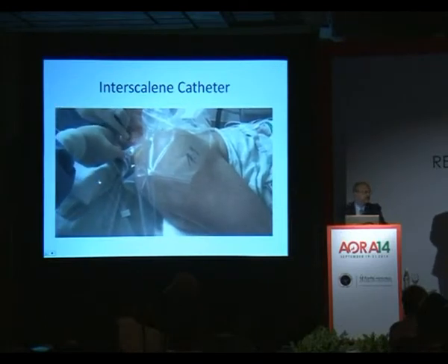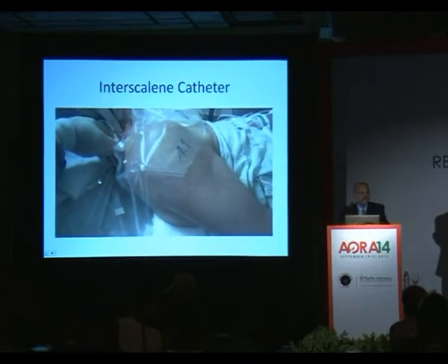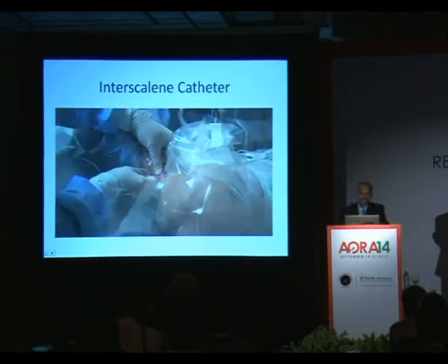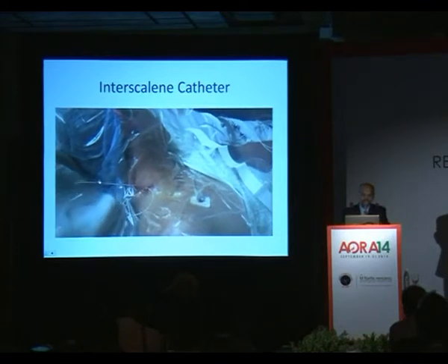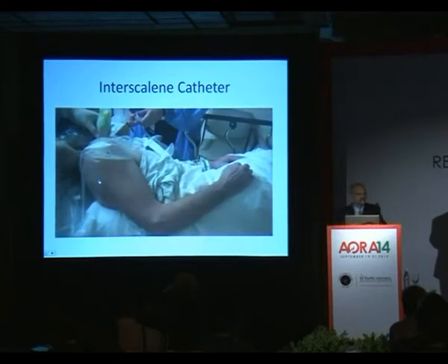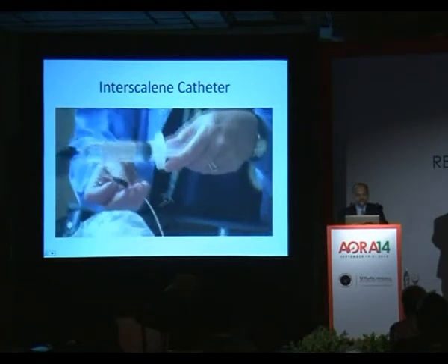Anytime you place a catheter, they have to be secured really well. In our practice, we tunnel all the catheters. And you have to use some kind of a mechanism to tape the catheter in place. Again, in our practice, we use tincture of benzoin, steri-strips, and Tegaderm.